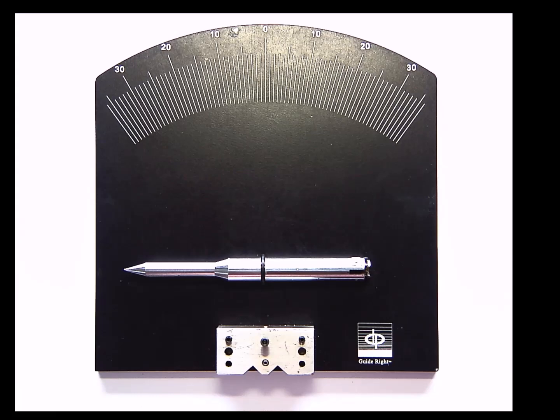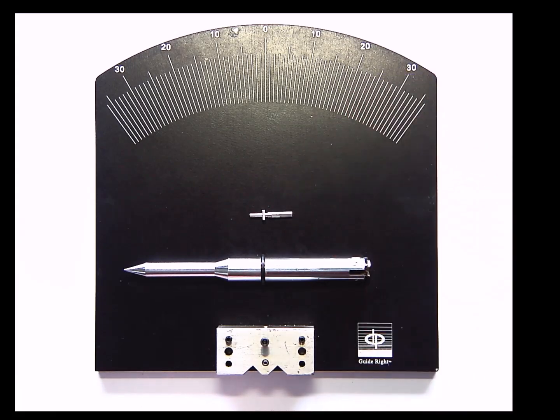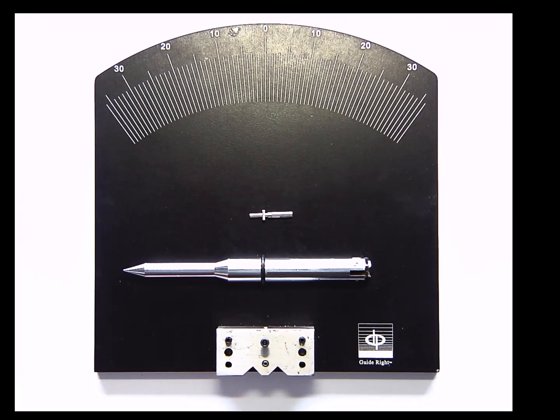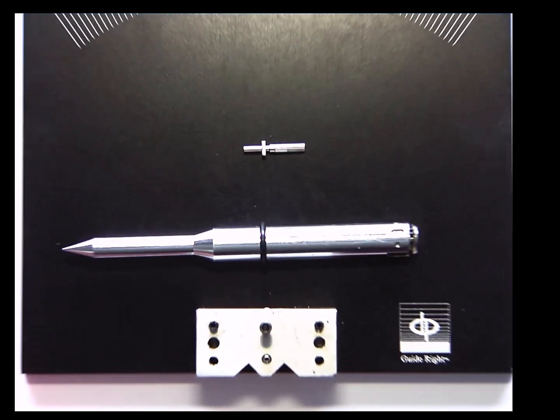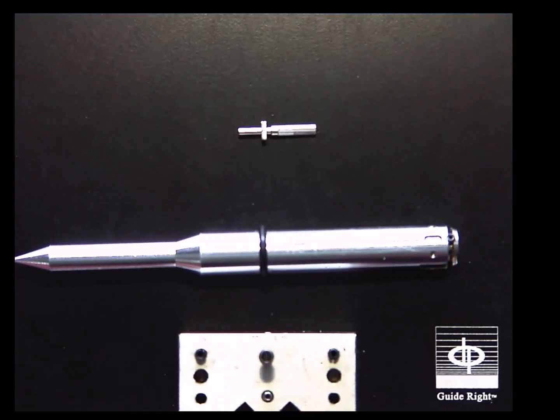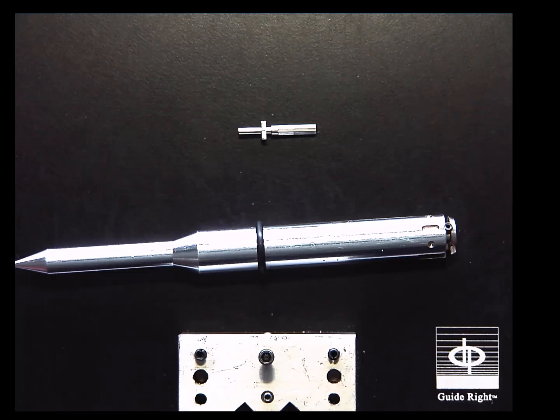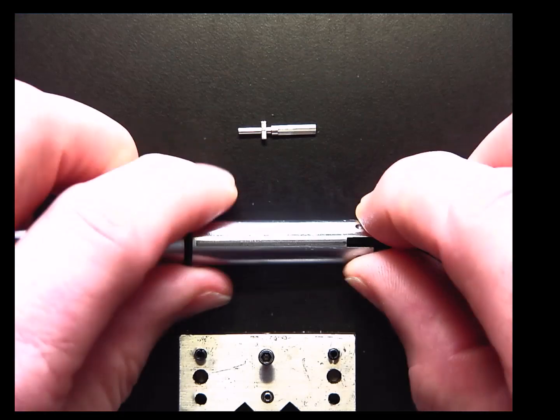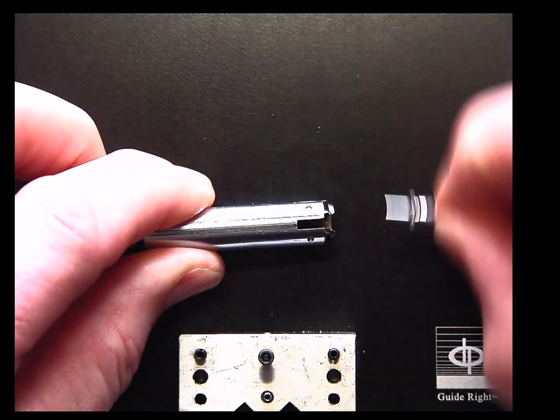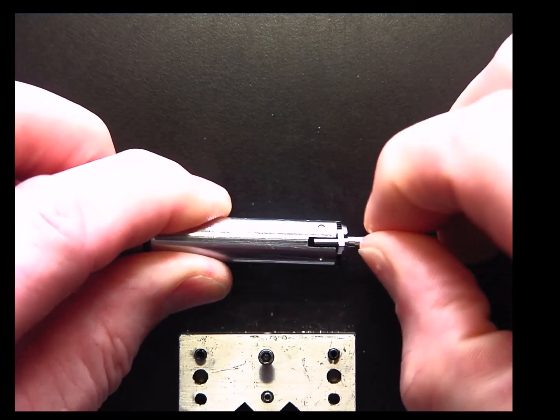The stylus and the guidepost are placed on the platform of the bending plate. The lower half of the straight two-piece guidepost is inserted into the rectangular slot of the stylus.